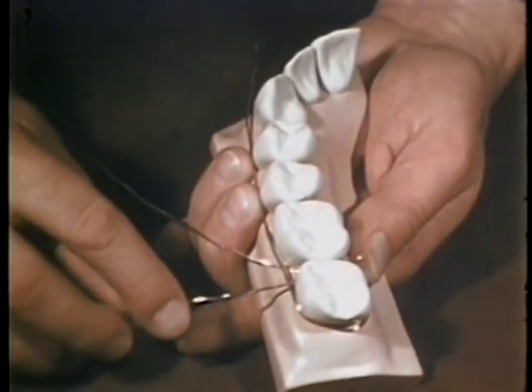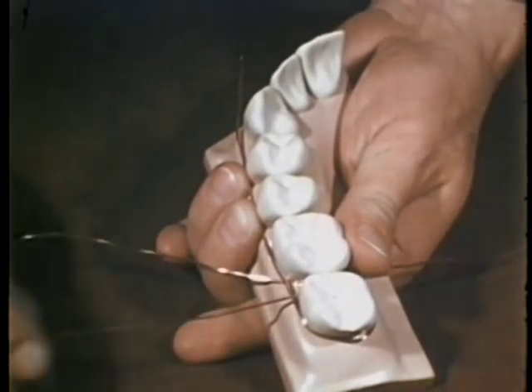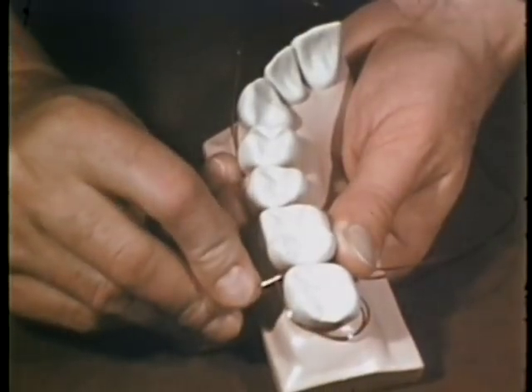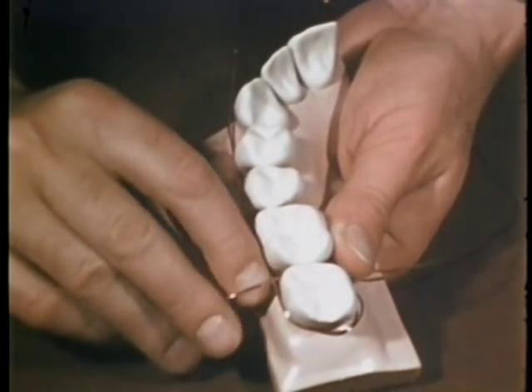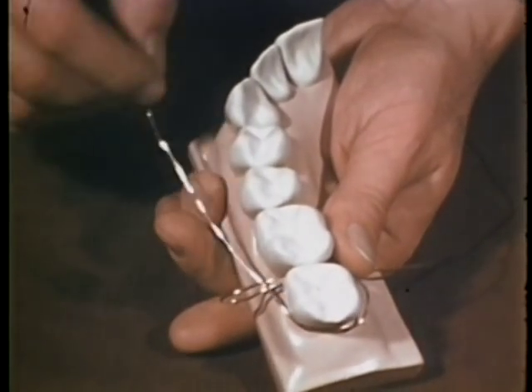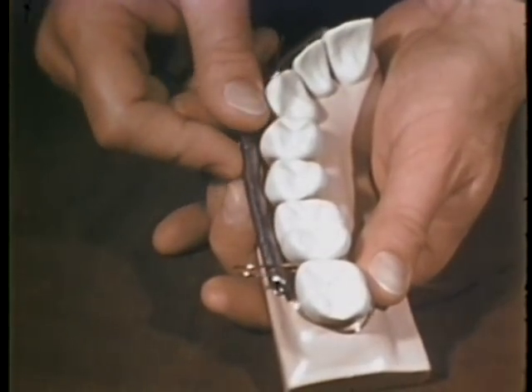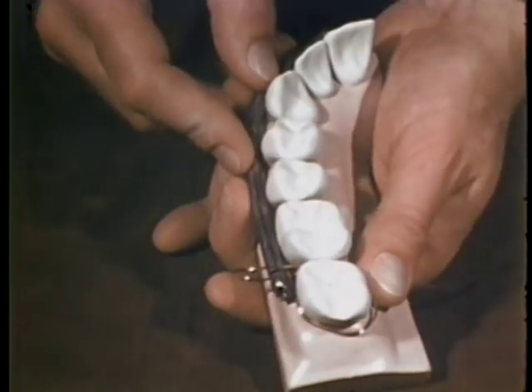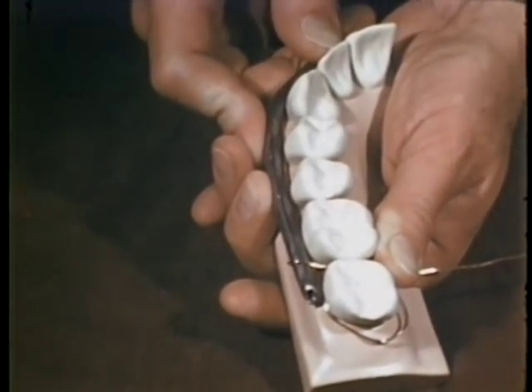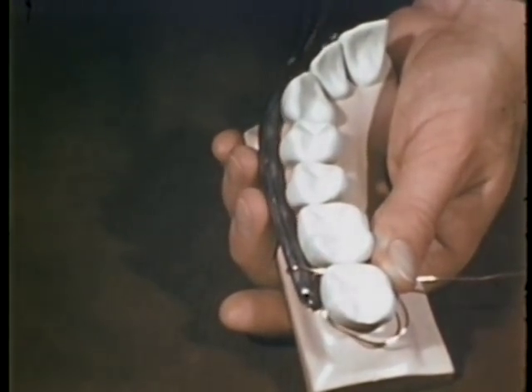The other end of the single strand of wire is now passed through the same interproximal space, but this time it is above or occlusal to the horizontal wire. A loop is thus formed around the horizontal wire. Lead solder is introduced to form and maintain uniform loops. The wires are tightened — first the loop is drawn taut around the solder, then the horizontal wire is pulled tight around the second molar.